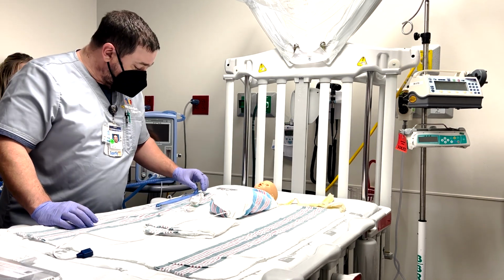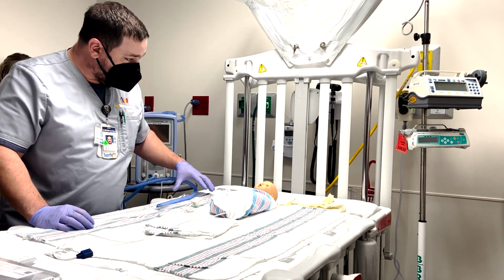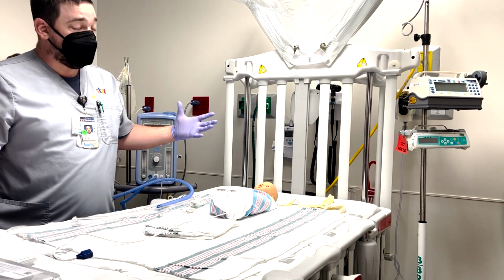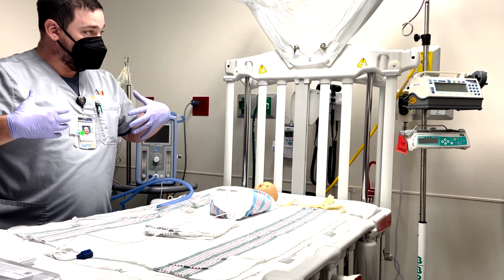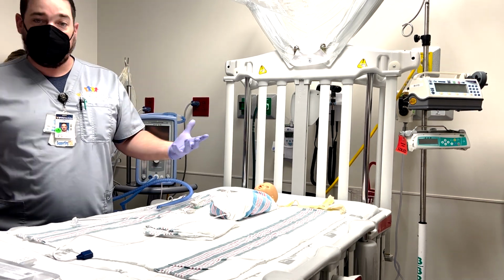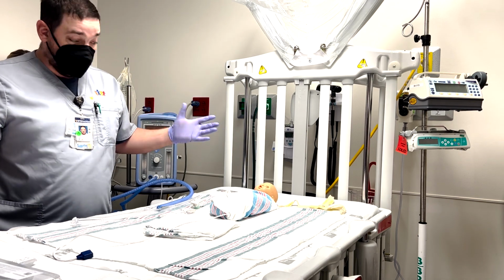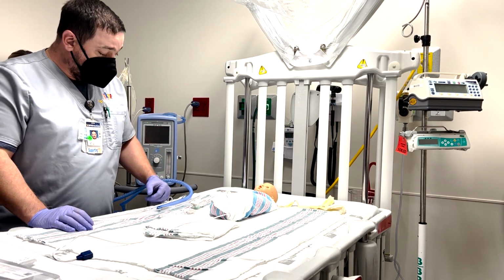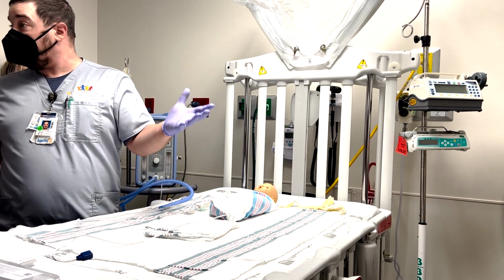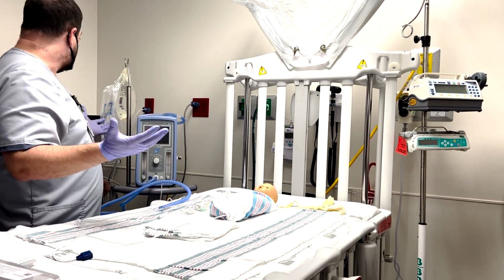All right. So, when we're talking about CPAP, the general idea we know is to increase functional residual capacity, make sure that we have a good PEEP level so we're setting the airways open, better diffusion across the alveolar capillary membrane. This is great. This is what we want to do. So the problem is where does it differ from high flow? Because most of you are used to high flow, correct? So the difference is this.